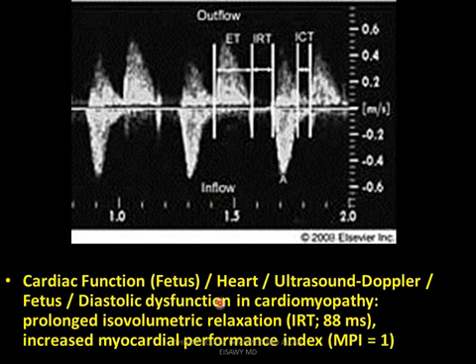Cardiac function in the fetus heart: ultrasound Doppler shows diastolic dysfunction in cardiomyopathy, prolonged isovolumetric relaxation time, and increased myocardial performance index, MPI. This is in cases of cardiac dysfunction.